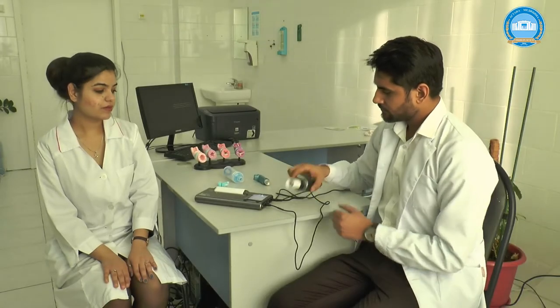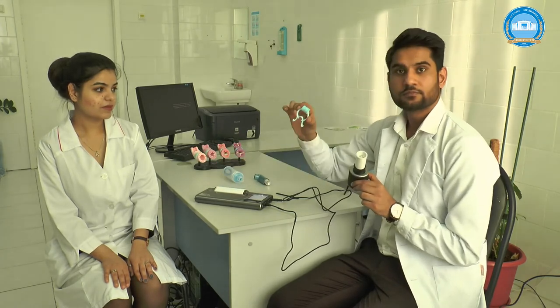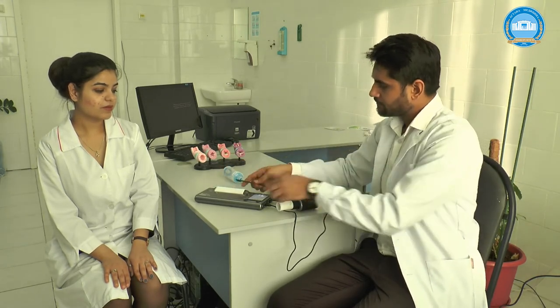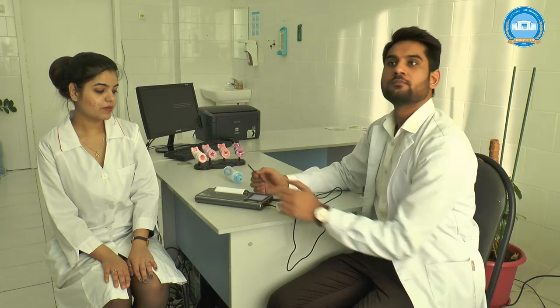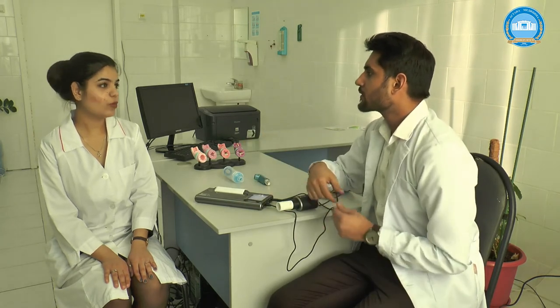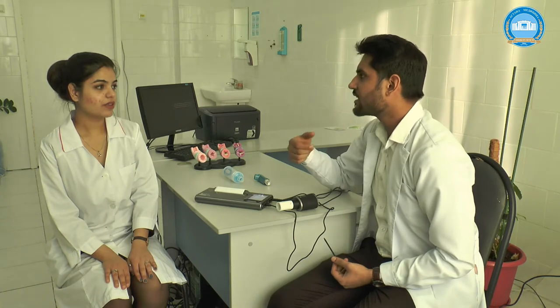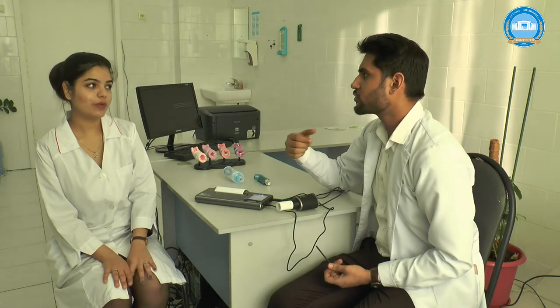Before starting the study, you should check the technical condition of the device and ask the patient questions about recent smoking before the study, existing disease, and the use of medications that may affect the results.